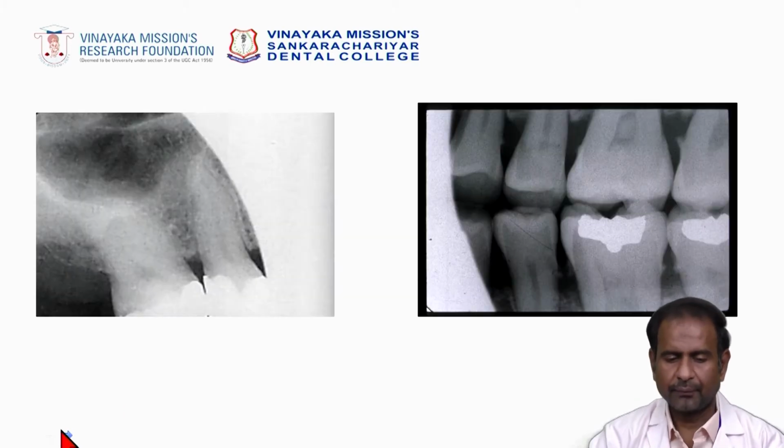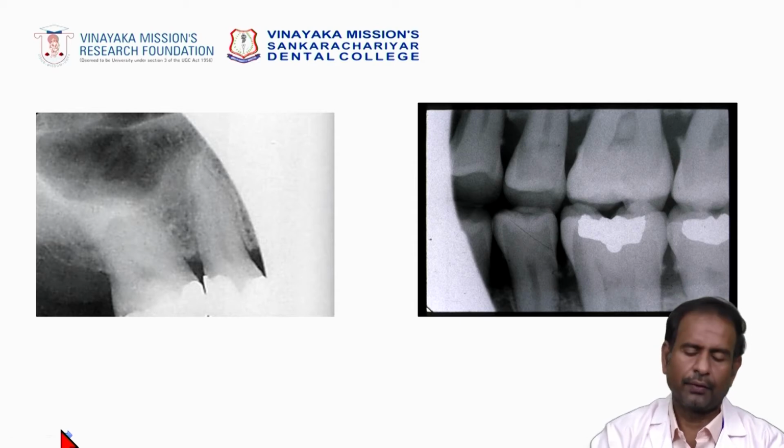See both the pictures. The image is only partially present. The partial image is only white in color because the cone is not positioned properly. This is always the cone cut. Remember, the cone cut is round in shape because the collimator shape is round. Beyond the collimator, there is no exposure. That's why the cone cut is always round in shape.